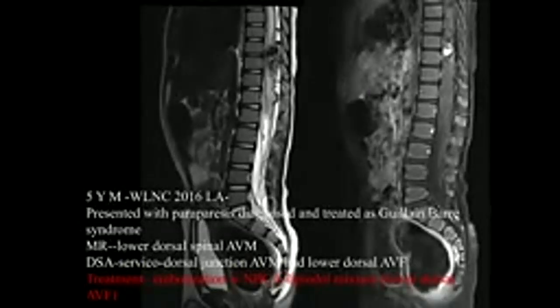But for AV fistula, perimedullary AV fistula and dural AV fistula are targets of embolization. Another one, ruptured. That is interesting. I want to ask all of you a question. Now that we look at the arrow, what is this? This is lateral. Who is saying that it is anterior spinal vein? Who is in favor of anterior spinal vein? Or artery? Who says that is artery? Who says, I don't care?